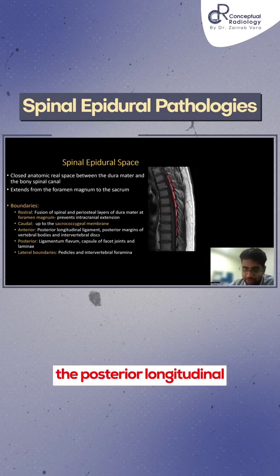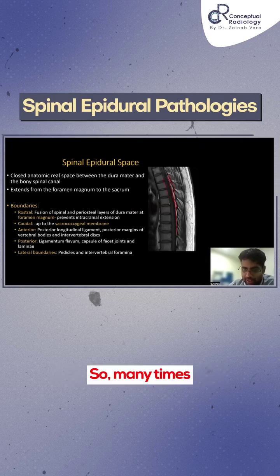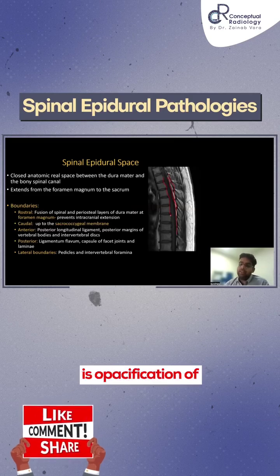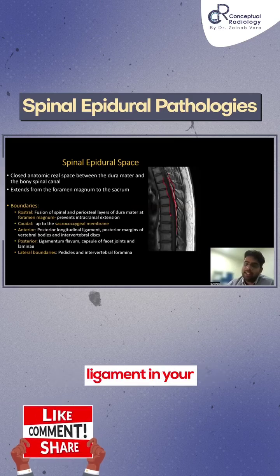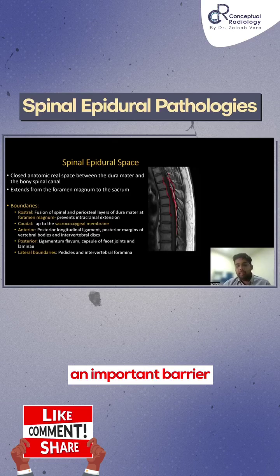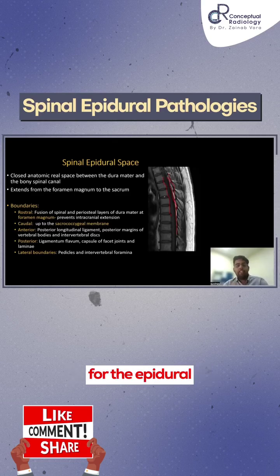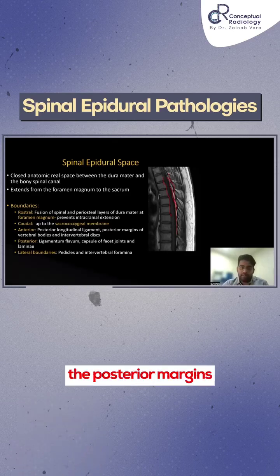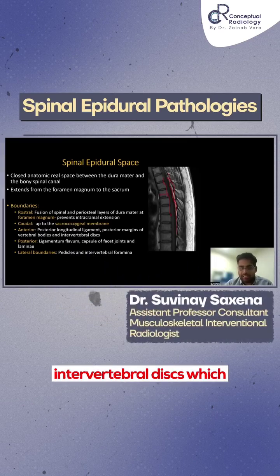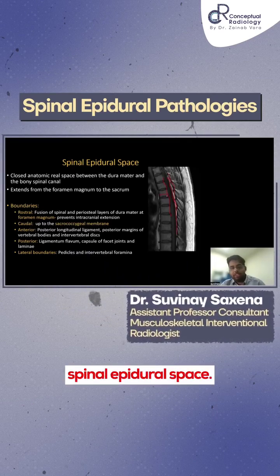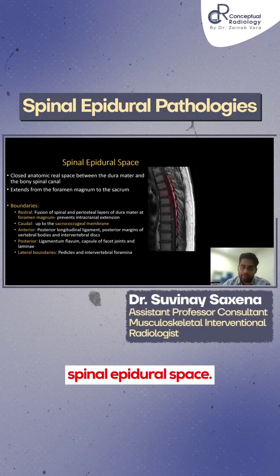This is the posterior longitudinal ligament. Many times you must be writing that there is ossification of the posterior longitudinal ligament in your reports, so it forms an important barrier for the epidural space. Then we have the posterior margins of the vertebral bodies and the intervertebral discs, which form the anterior border of the spinal epidural space.